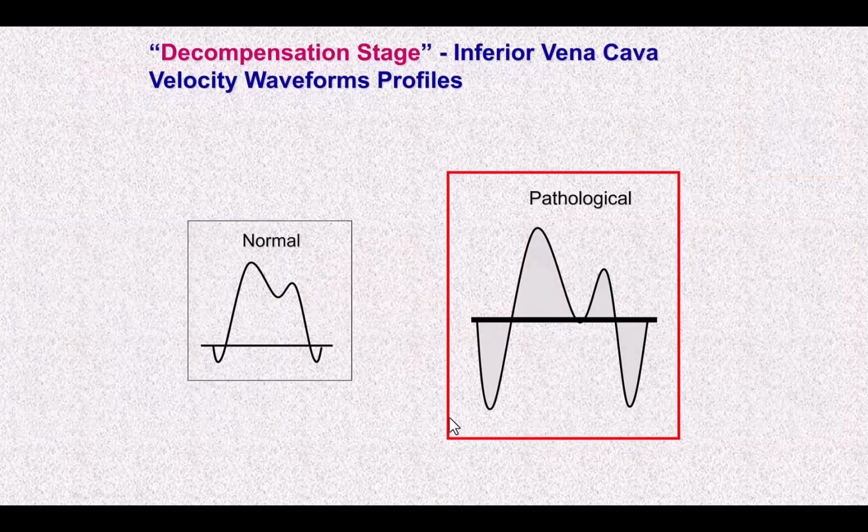If we look at the right venous return, we can find the same condition. You can see here that in normal condition there is very small reverse flow during the atrial contraction. But look here what happens in this situation: reduction of forward flow and higher velocity in correspondence with the atrial contraction.